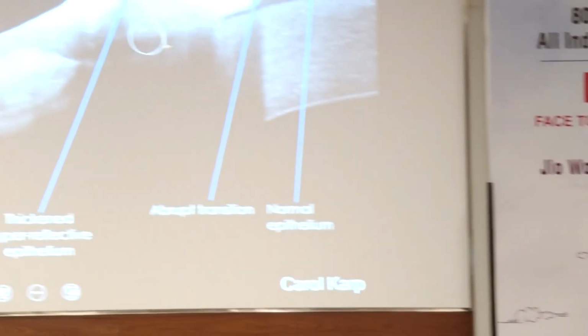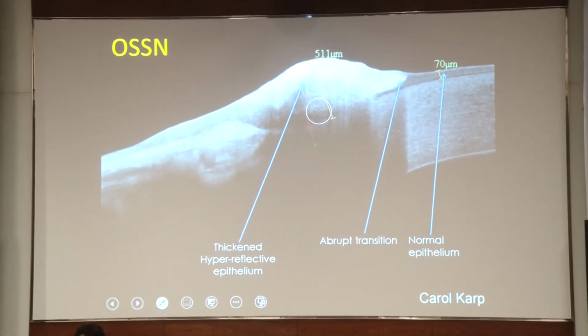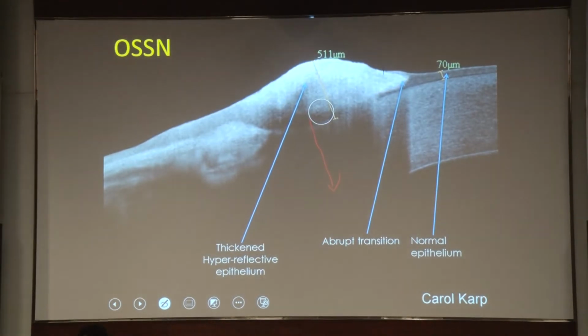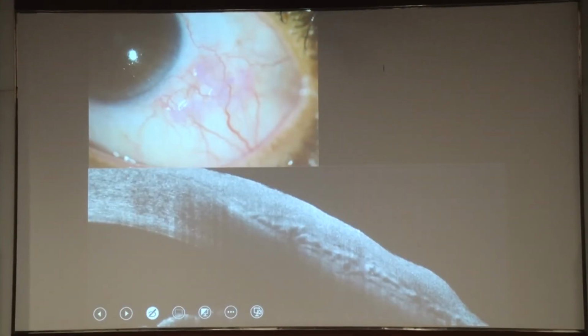While the edge is easily determinable on clinical evaluation, a good slit lamp evaluation will tell you about the edge. How do you know the base? Base is something that is always a suspect. Slit lamp will not tell you very clearly about the base because you cannot see through the tumor many a time. Then comes the role of imaging. Of course, anterior segment OCT has some disadvantages because in the areas of keratin there is some shadowing. You'll still be able to estimate the depth of the lesion. Of course, diagnosis is also part of it.